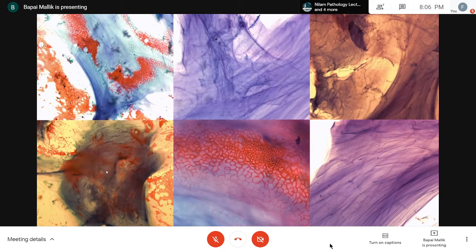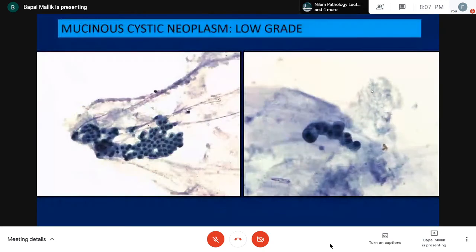This is a collage of mucin. I couldn't help putting this up, and it looks pretty stunning from various angles, very thick mucin. You can see this kind of strands like paintbrushes. They also trap RBCs in very spectacular ways. So this is all the stuff where you can be pretty certain that you're dealing with mucin and nothing else, and this is very vital.